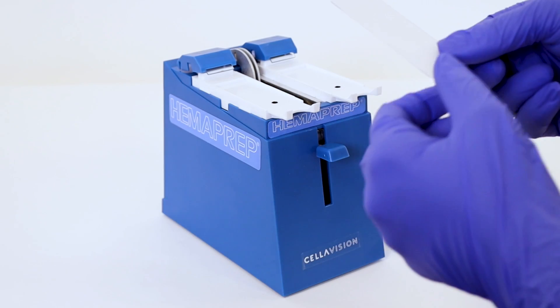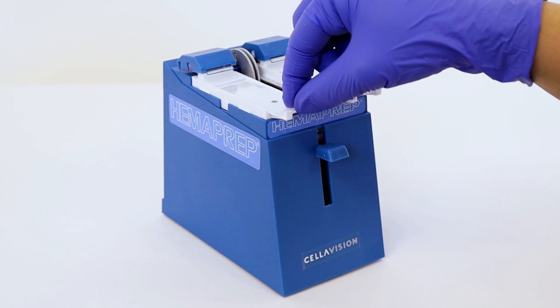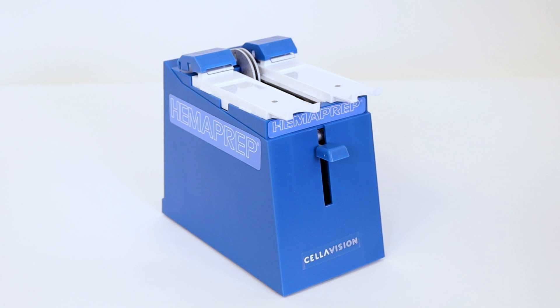Place two slides in the slide holder with the frosted end up and towards the front of the device. If you only need to make one smear, still add a blank slide as a counterslide.